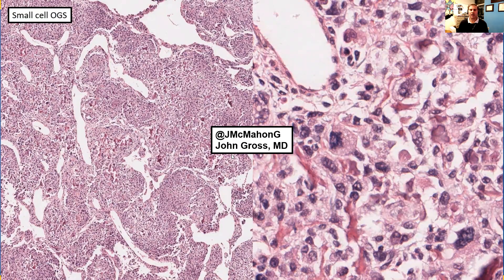Here we have an example of small cell osteosarcoma — the left being low power, the right being intermediate to high power. You can see purple-pink matrix mineralization throughout within a filigree pattern of primitive small blue cells. On the right you can appreciate this matrix mineralization better, with these relatively small primitive cells showing a little cytologic atypia, which directly produce this matrix mineralization.